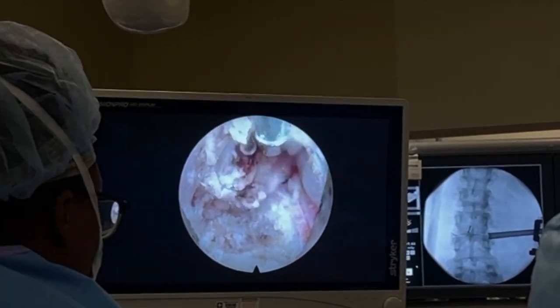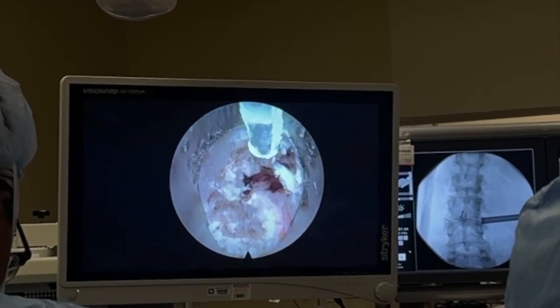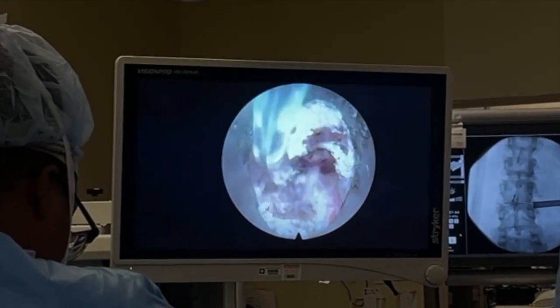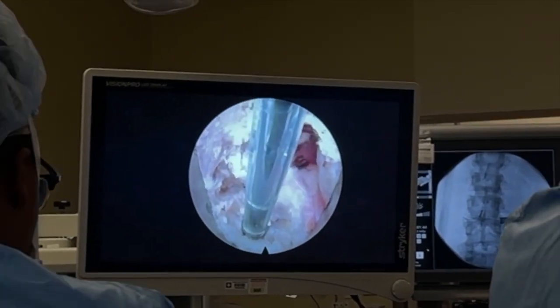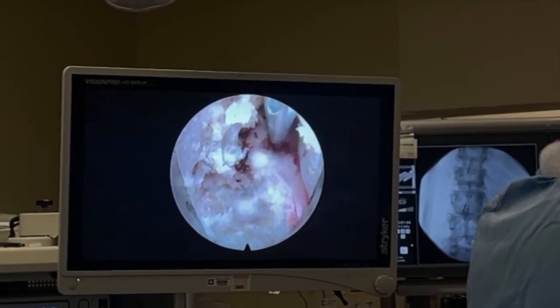Because you know, my mama always said, spine surgery will be a lot easier without blood vessels and nerves. So we're monitoring any jumping, and we've got electrophysiologic monitoring over in the corner. You'll hear them go, we have a burst, we have a spike, we have a train. All those different pieces of information help me make sure that the nerve is safe. That and my eyeballs. And the force, Luke, the force.